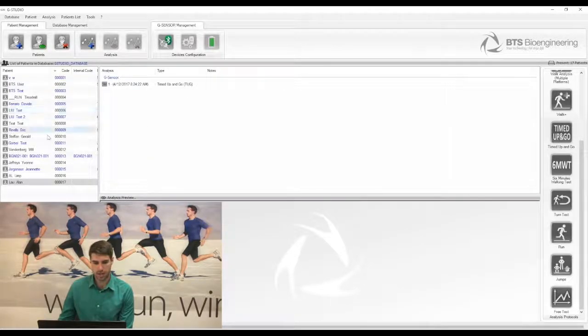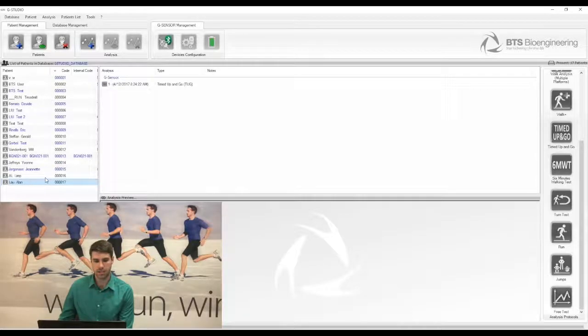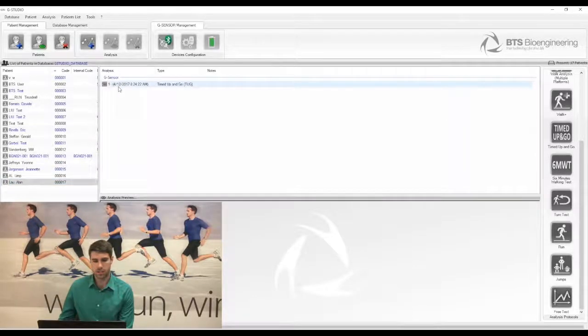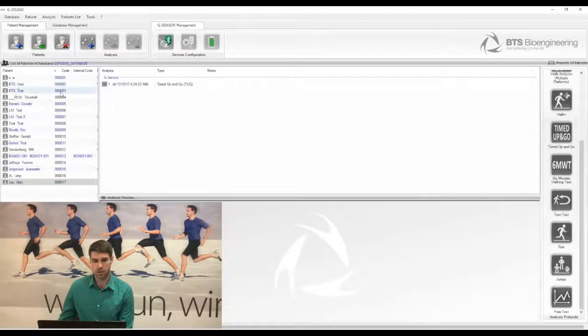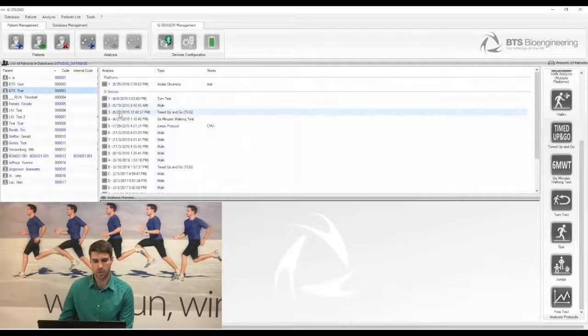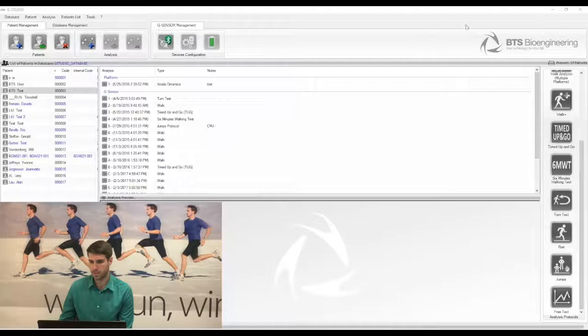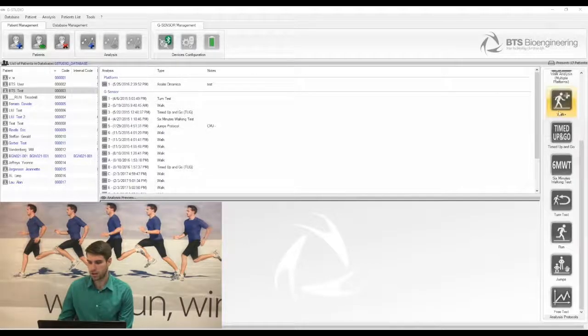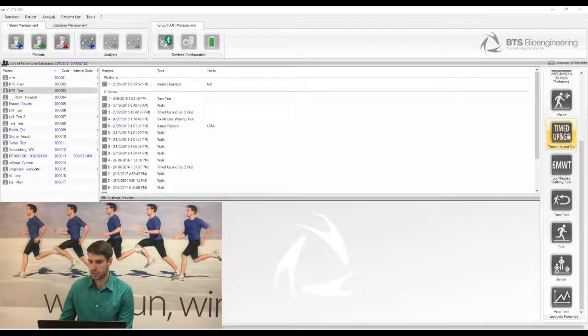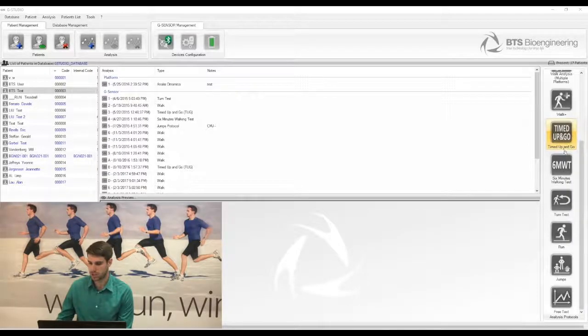On the left side you can see a list of all of your patients, and by selecting one of them you can see all of the tests that you have performed on that patient as well as the date that you have performed them. On the right side you can see a list of all the protocols that are available for you to choose.